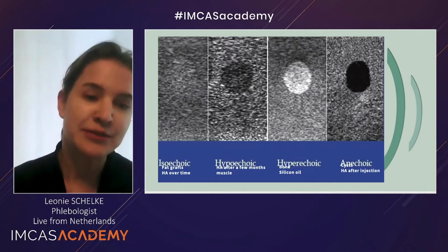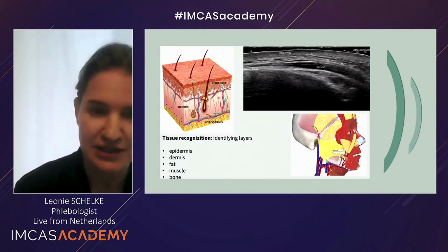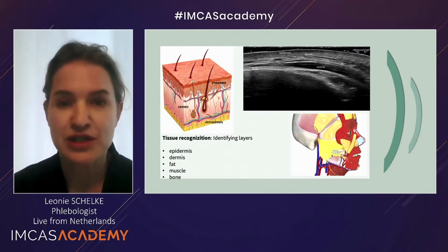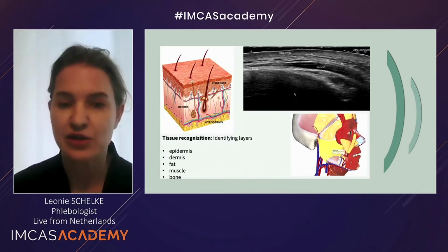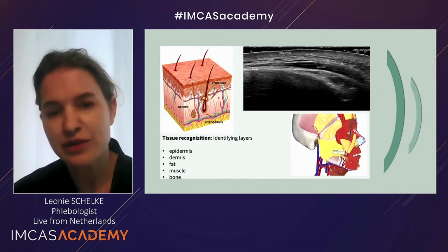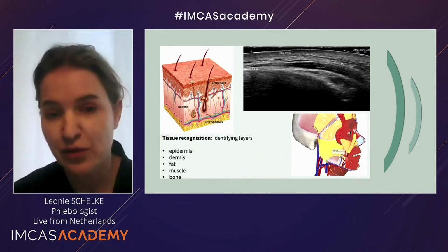So that's what you see with ultrasound, but every structure has its own echogenicity. We are used to these nice and neatly organized images in our anatomy book, or to cadaver images. If you look at this black and white grayish stuff in ultrasound, I can imagine that in the beginning it really looks messy to you. But if you develop your eye for it, you will see that these images are as organized as your anatomy book, but in black and white.